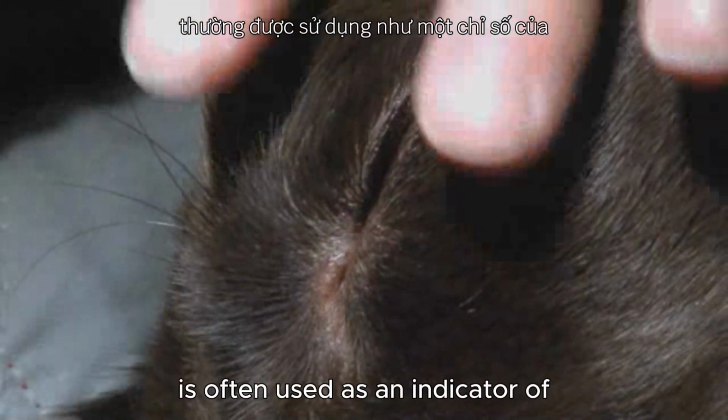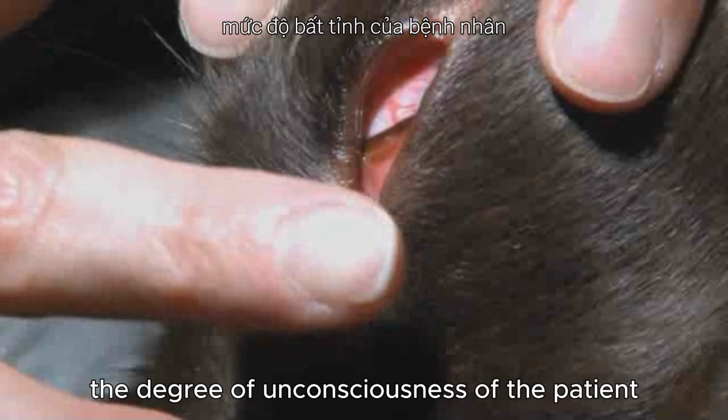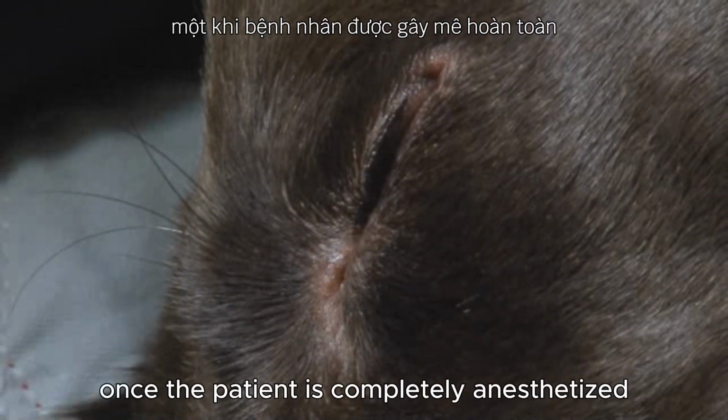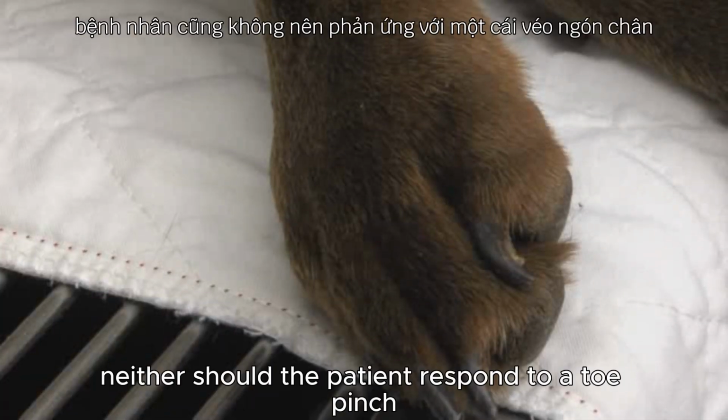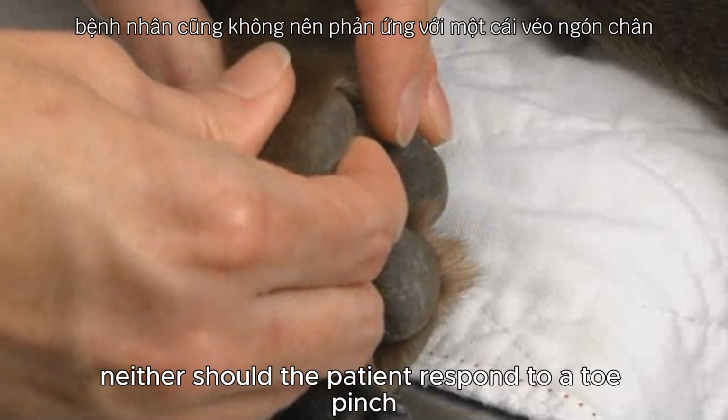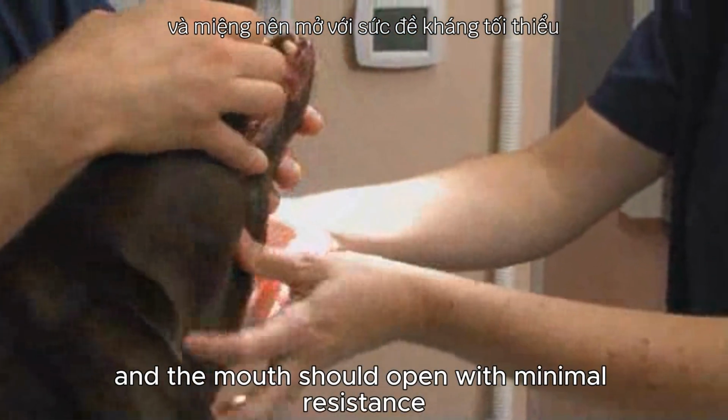Monitoring eye reflexes is often used as an indicator of the degree of unconsciousness of the patient. Once the patient is completely anesthetized, the eyelids should not respond to a gentle touch. Neither should the patient respond to a toe pinch, and the mouth should open with minimal resistance.